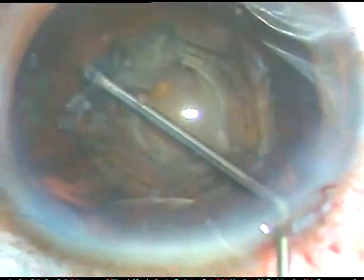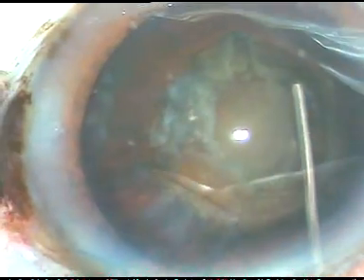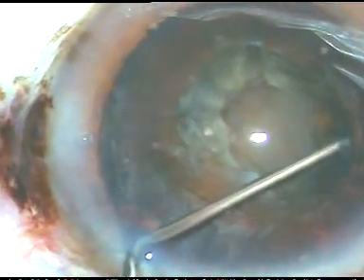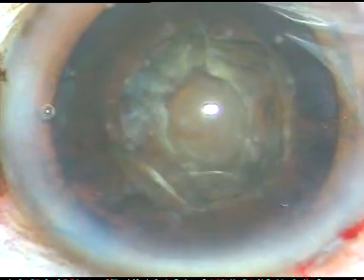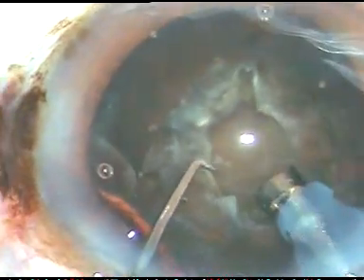I am irrigating the epinucleus like this and doing a bit of hydrodissection at multiple points. This is a good idea which I got from Dr. Ramakrishna recently and I am employing the technique in this case. So hydrodissection is done, now I am going to do the case as if hydrodissection has not been done. I am not going to rotate the nucleus at this moment.